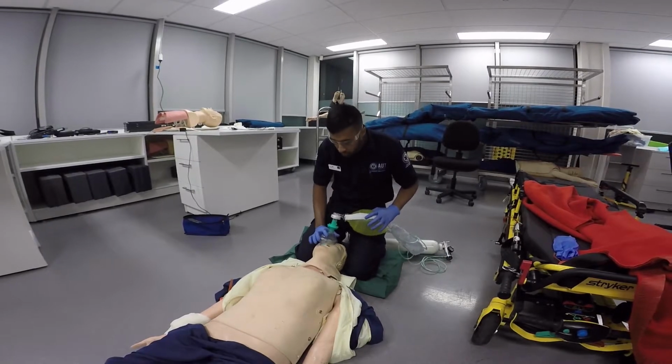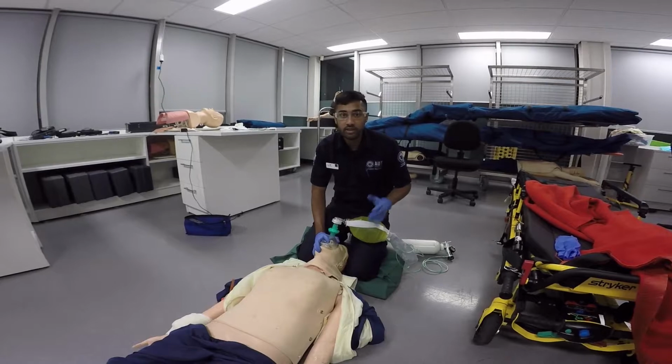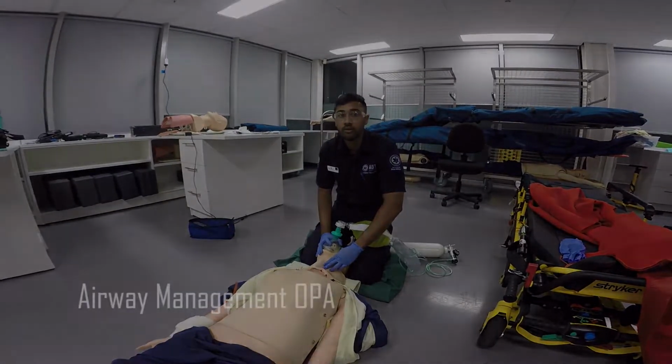When ventilating the patient, we use the C and E grip like so, and when we ventilate, you ventilate once every 5 to 8 seconds, assessing for chest rise. If you start to see gastric inflation, you can apply cricoid pressure.